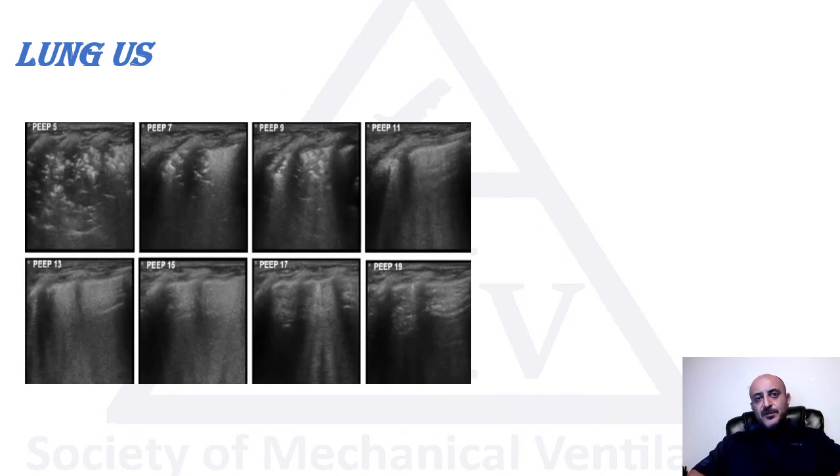Recently, there's been a lot of interest in lung ultrasound in clinical practice and the ICU, and it makes sense because it's very cheap, it's reproducible, there's no radiation exposure, and you can repeat it over and over. The problem is it needs some expertise in interpreting the ultrasound or acquiring good ultrasound images during the procedure. So there are a lot of studies about using ultrasound in recruitment and evaluation of recruitment and adjusting the PEEP.